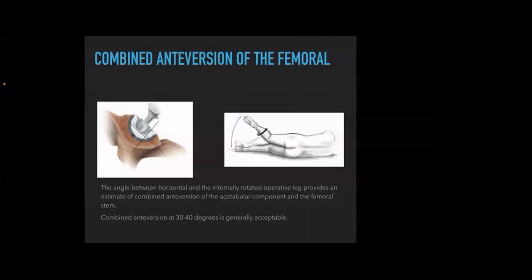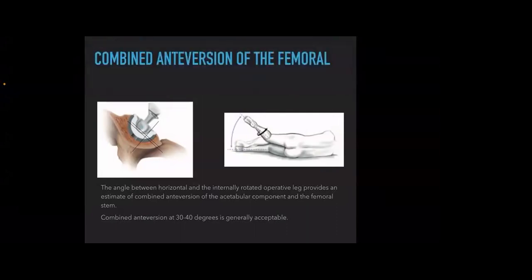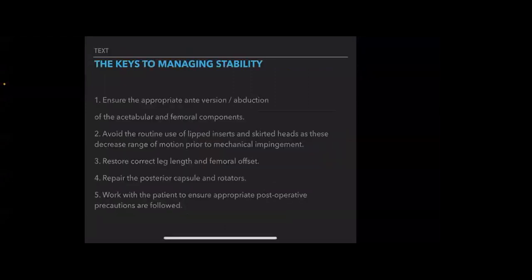The other technique is what is called the Ranawat technique, where you draw lines parallel to the acetabular rim as well as the head rim. So they should be parallel at 45 degrees of extension. I think Dr. Yadav may later confirm that; I have not put that slide here. The Ranawat technique, concentric lines: the line on the rim of the acetabular cup and the line on the head should be concentric, the head concentrically inside the acetabulum in extension, and I think 45 degrees of abduction. I will confirm that with Dr. Yadav.